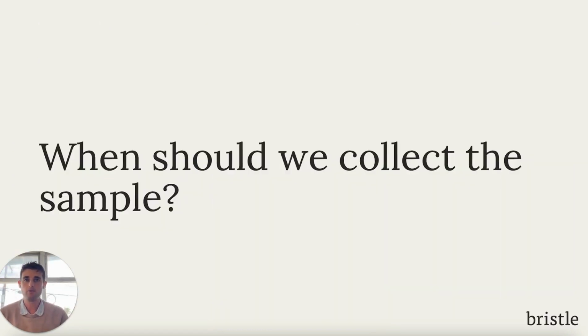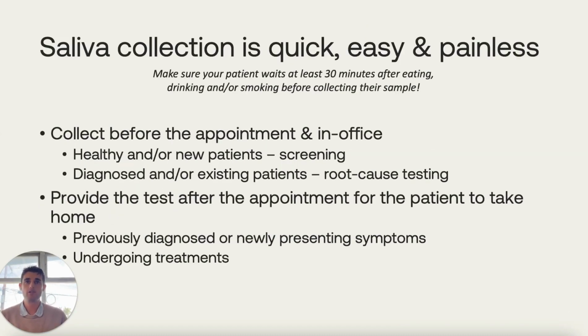Collecting a saliva sample is easy and painless. If you have questions about how to collect saliva samples, you can watch our video by clicking the link shown below. In all cases, please make sure your patient avoids eating, drinking, or smoking for at least 30 minutes before providing their sample. Keep in mind that you will never collect a saliva sample during or directly after the patient's appointment. This is because the treatments you do during the appointment, like a prophy, will alter the patient's oral microbiome and skew their test results.